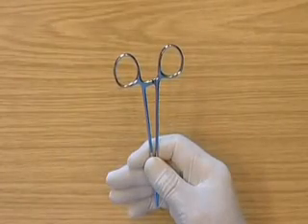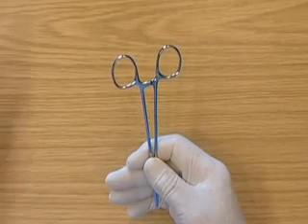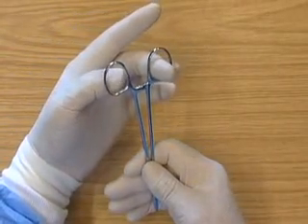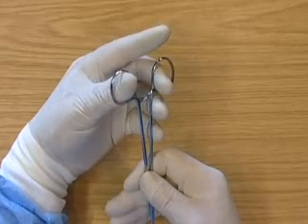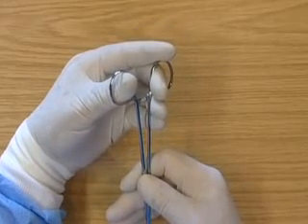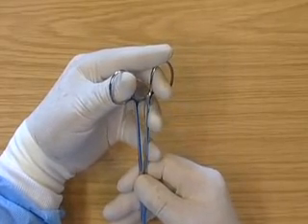This is the left handed reverse surgical grip. The second finger is placed through one ring. The thumb is placed through the other ring. The first finger is placed on one of the rings and the third and fourth fingers are placed along the side of the holders to support the holders.